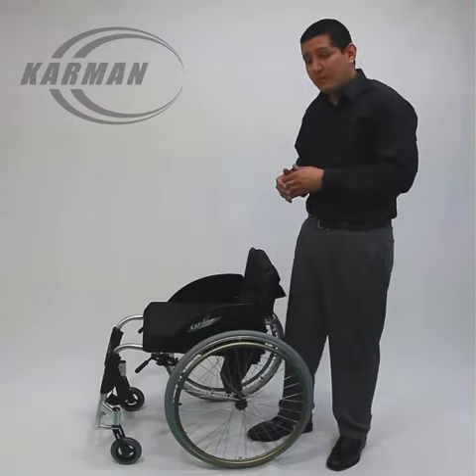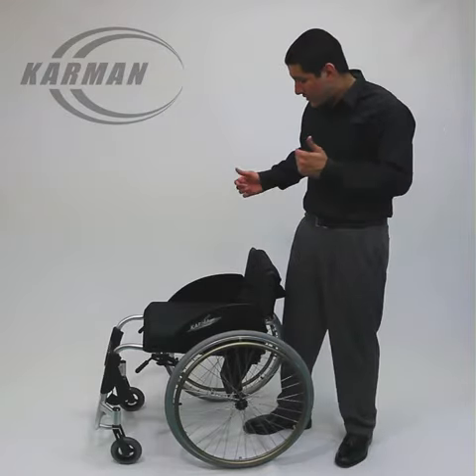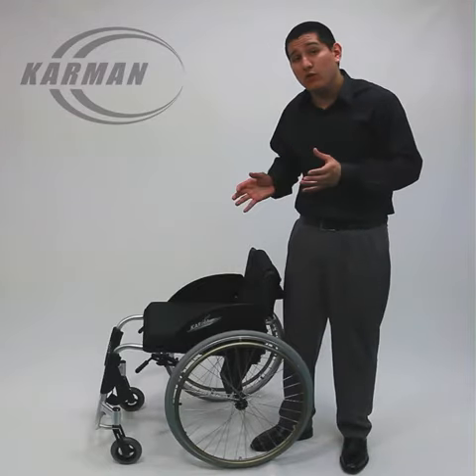Seat depth is available, different seat widths are available, backrest height, and of course it is a foldable backrest — making it an even much better active chair because it is foldable.